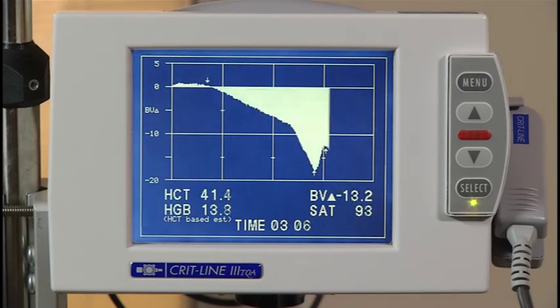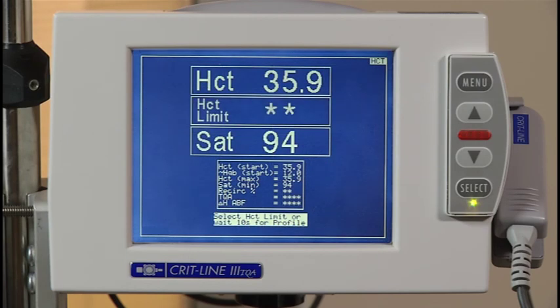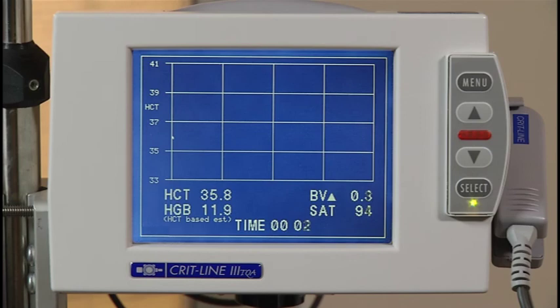If you know the hematocrit limit of the patient you are monitoring, you can enter it by pressing the up arrow button until the proper number has been entered. When the hematocrit limit is set, the dashed line will appear on the screen.